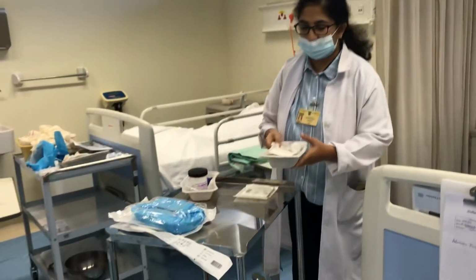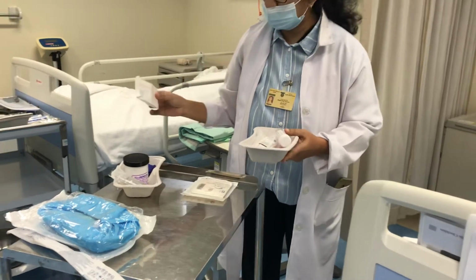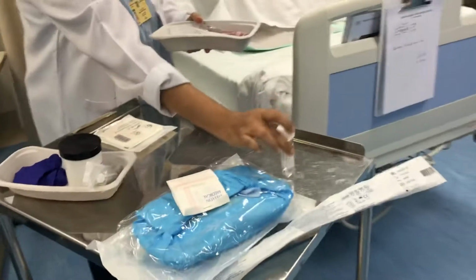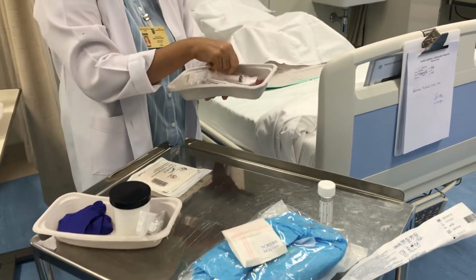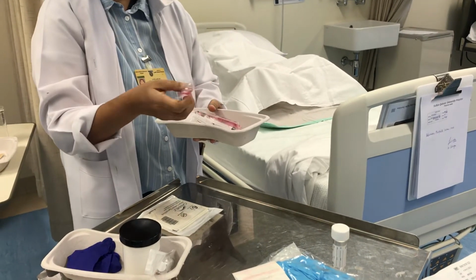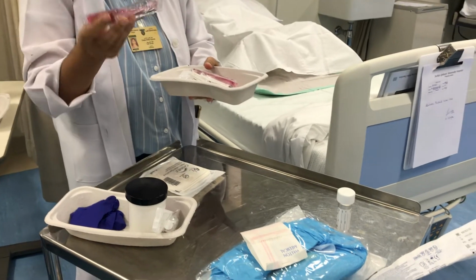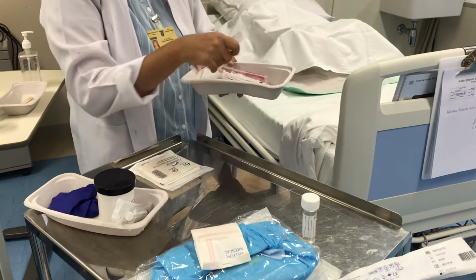Then we are also going to have some gauze pieces, sterile ones. Then the urine collection receptacle, the urine collection bag. And also we need some antiseptic solutions like this. These are the antiseptic solutions which are used for perineal skin care, the same solution we have used for other perineal care.